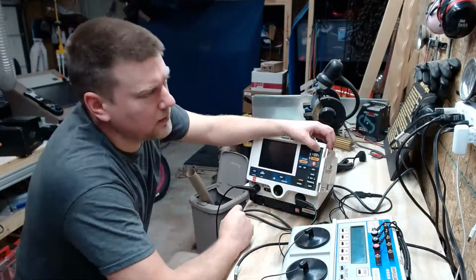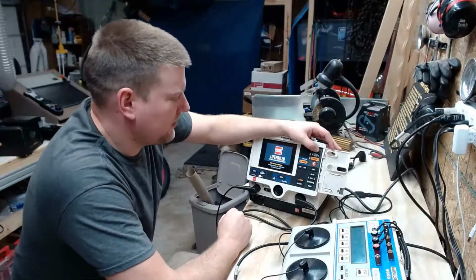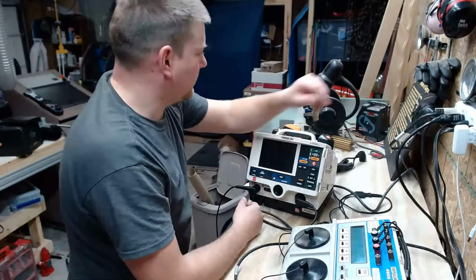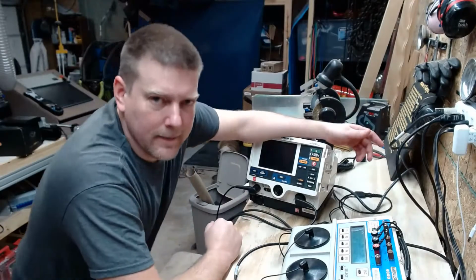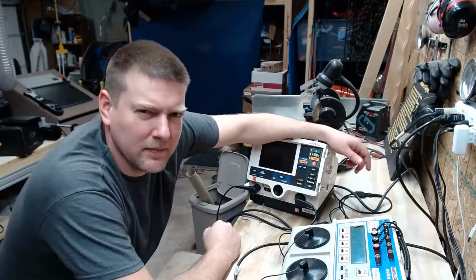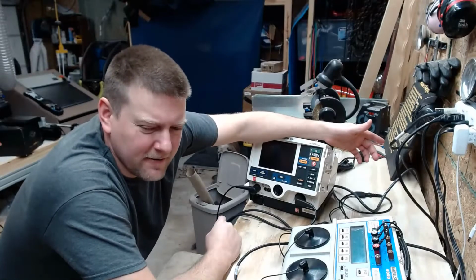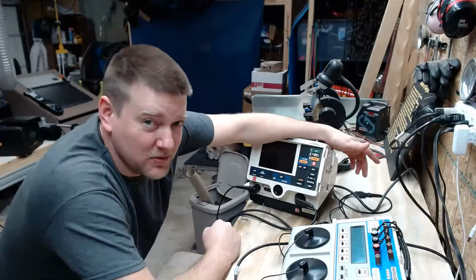Let's reboot the defib. So that is pacing in a nutshell. It's the defib actually beating the heart for the patient. I'm glad I got that on camera. Did you guys see that? It was booting up and it shut off on its own. That's really interesting.